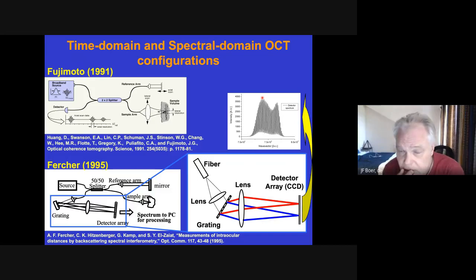It means that for this wavelength, the path length difference between a sample and a reference arm is an integer times the wavelength, because then the wave from the reference and the sample arm will constructively interfere and create an interference maximum. Now, if I change the wavelength a little bit, it will not fit the ideal integer number anymore on the path length difference.